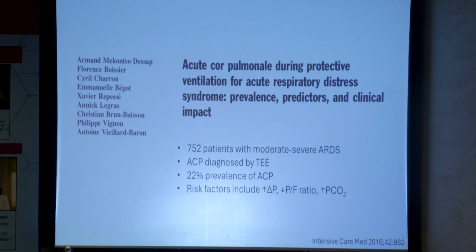So they heal. Yeah, a big part of them will develop DVTs. So Lena is very particular when she is using them, she will put something like an IVC filter. But most of them, if they are clearly contraindicated to anticoagulation, then we will consider an IVC filter. And when these cannulas are removed because the patient has improved, you basically have purse strings around the cannula, pull it very tight, hold pressure for a long time. But that's at the skin level. We never address the hole in the vein. Because it is percutaneous, it's not an issue at all.